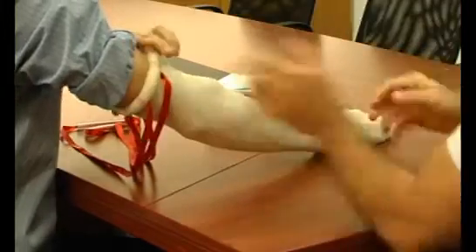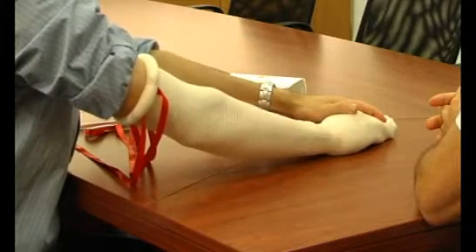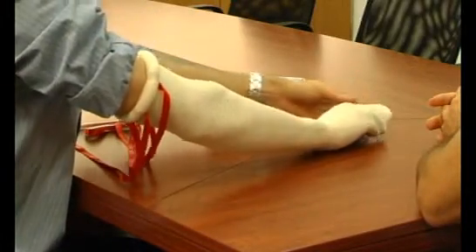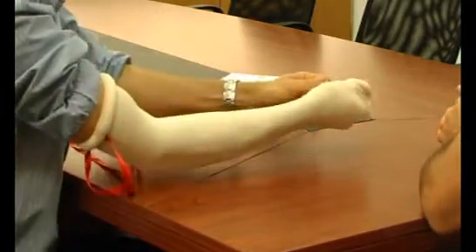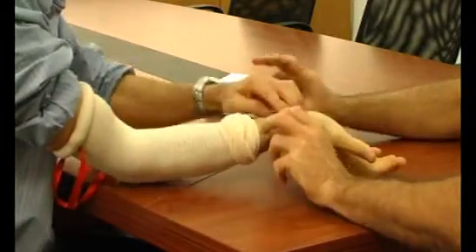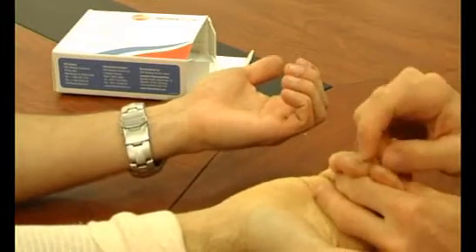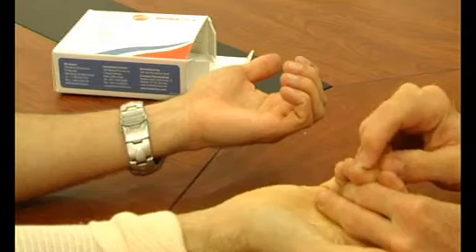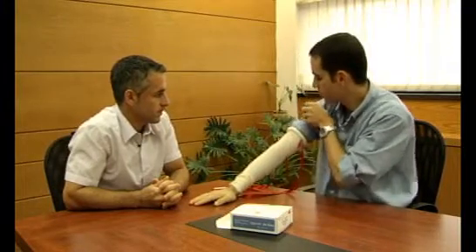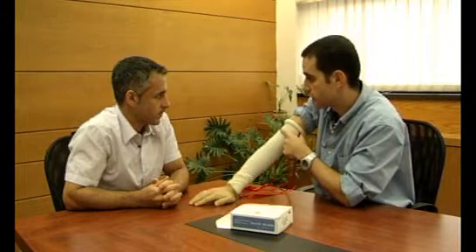Wow. And you also open a sterile field, so you can now start the procedure — either by opening a window or taking the stockinette off. It looks very good. Let me see your hand. This is my hand without any blood. You can feel I have no pulse. Very nice. Before I take this off, you can see that thanks to its sterility, you can work in a bloodless environment in places that you cannot work today.